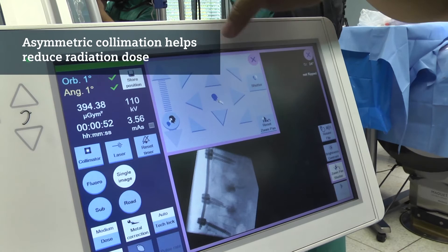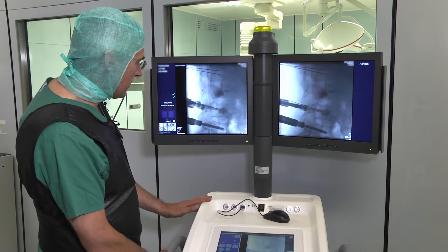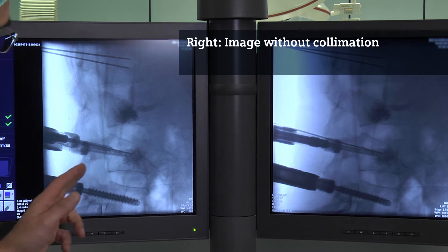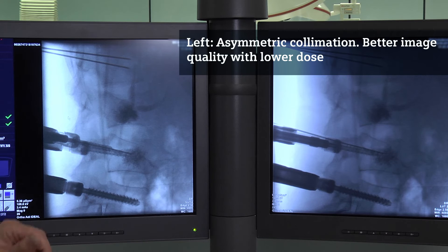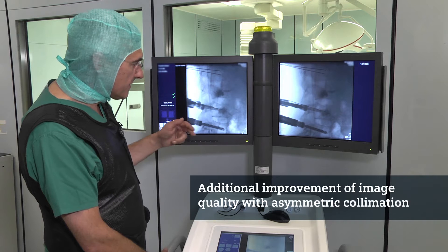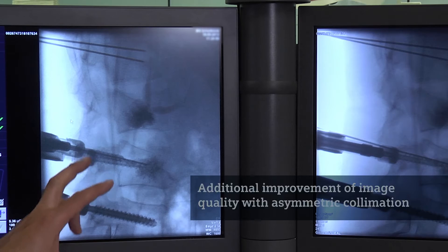It gives us the possibility to reduce radiation intraoperatively significantly. You can see an example here in the case we did today with a lumbar fusion. On the left-hand side you see the image with collimation where we reduced the field of view in the part where the instrumentation comes in from the dorsal side, and that leads to a significant improvement of image quality in the region you are focused on.